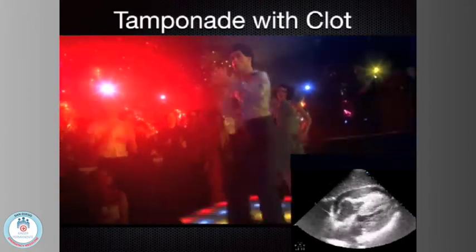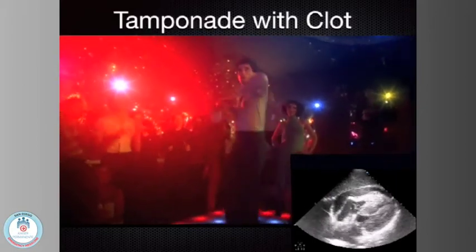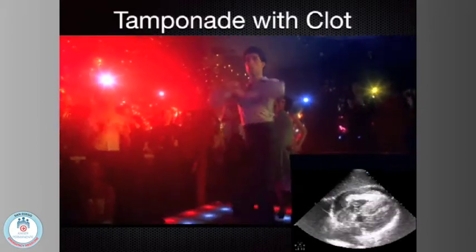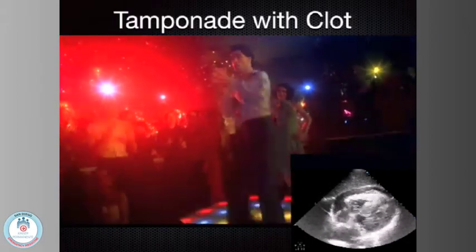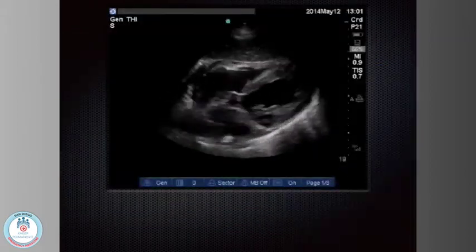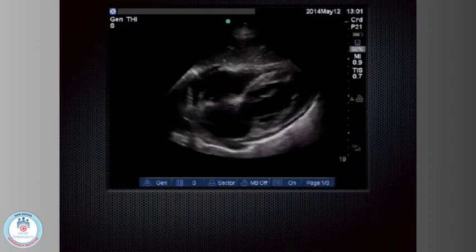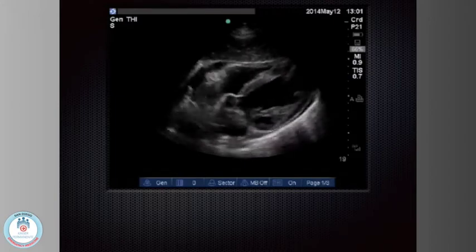And with tamponade, it's diastolic collapse of the RV. But it's kind of hard to tell which is diastole and which isn't. But if you look, you'll see that dancing back and forth, and to me that means there's tamponade there. The question is, what's tamponade and what's just a pericardial effusion? You're going back and forth on this all the time.